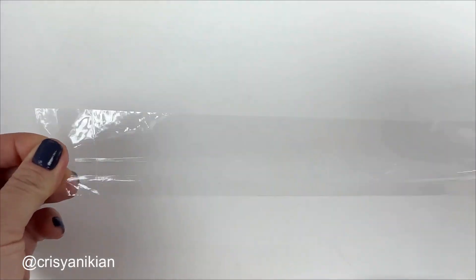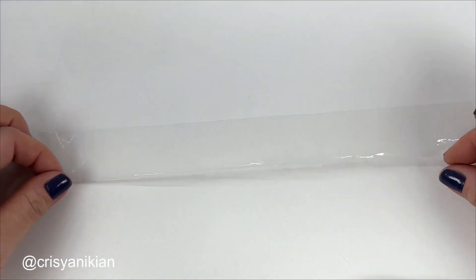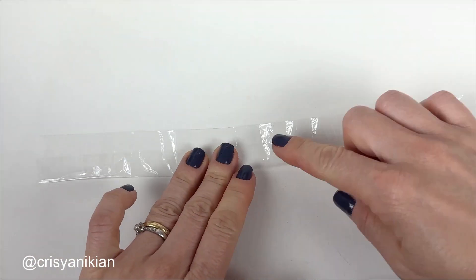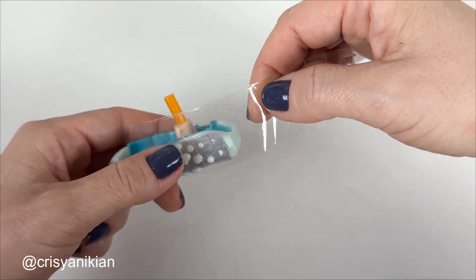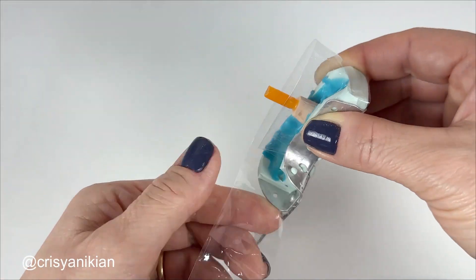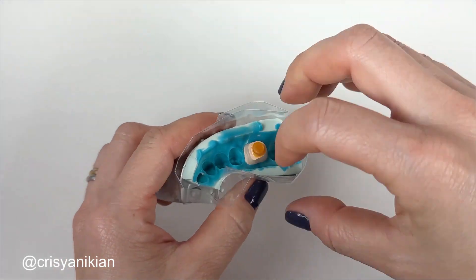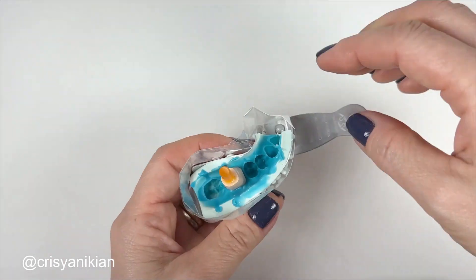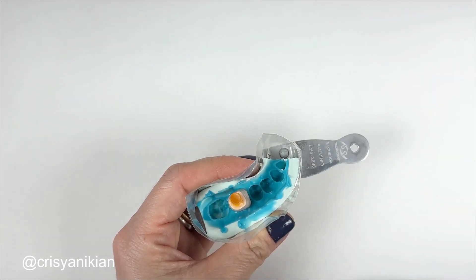Before pouring the plaster, create a barrier to define the cast base shape. You can use a piece of wide adhesive tape for this purpose. Fold the lower third of this tape and use the adhesive portion to wrap it around the mold. Note that the heavy silicone mold was cut too much, so fill that space with modeling clay to prevent the plaster from filling it and deforming the cast.